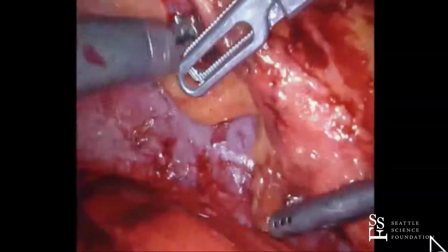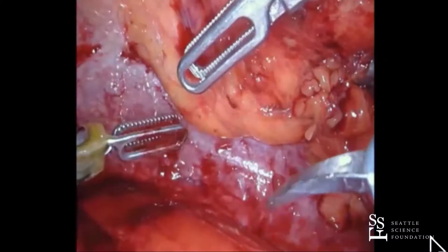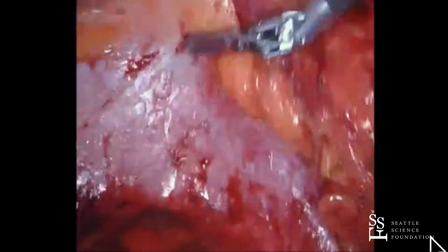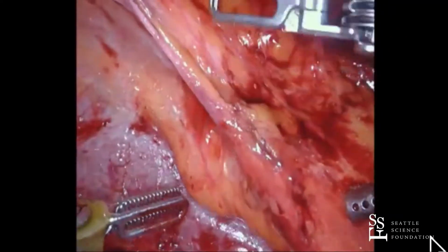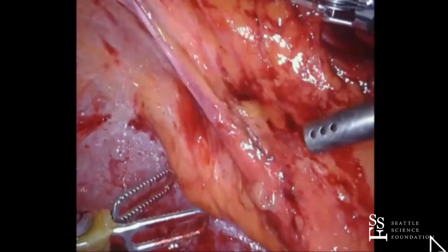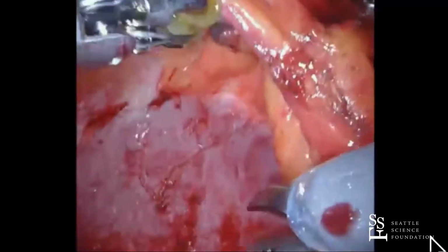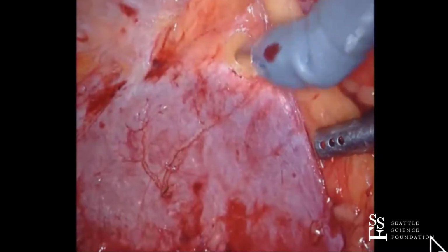this is the fat outside your Gerota's fascia right here. In this case, I'm going to just show you, we'll take it off. We don't really need to, because I can just hold up on it like this. But I just want to show you what you can do if you have a lot of fat here. Now, of course, what we'd like to do is not enter the peritoneum when we do this, or your Gerota's fascia if we can avoid it.